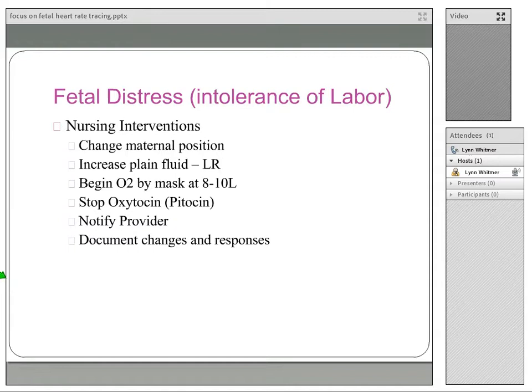So with fetal distress, what you saw, some late decelerations or decrease in baseline or decreased variability, we're going to be concerned about that because that means baby's not coping with the labor process, which is a traumatic event for a baby. It can be stressful for a baby. And if his environment's not been healthy, he's not going to cope very well with this constant pressure with these hypoxic events, as I call them.